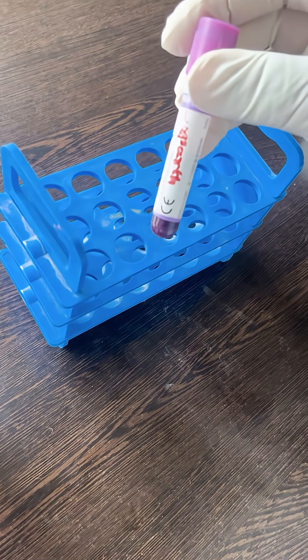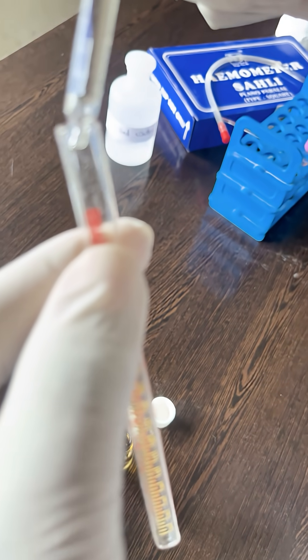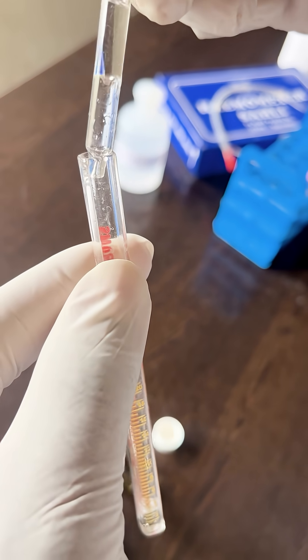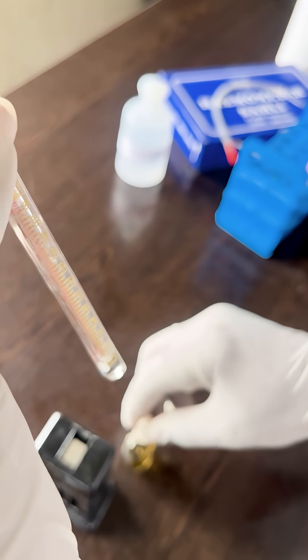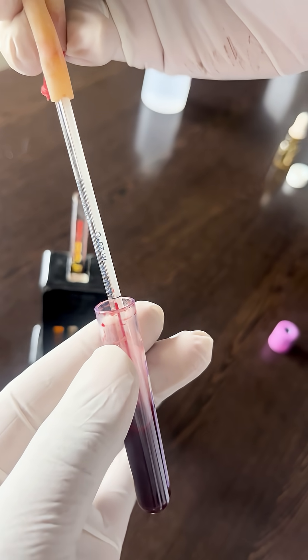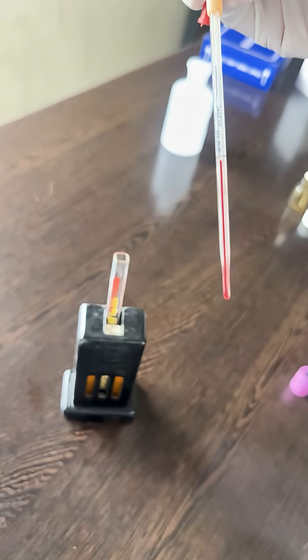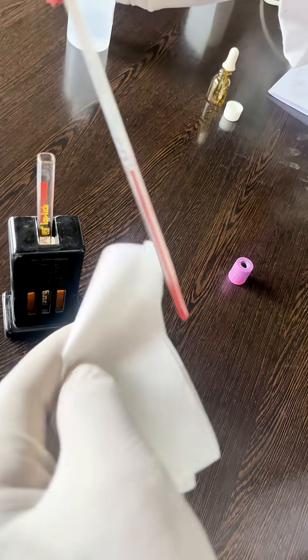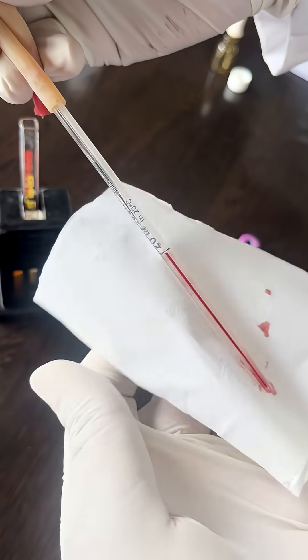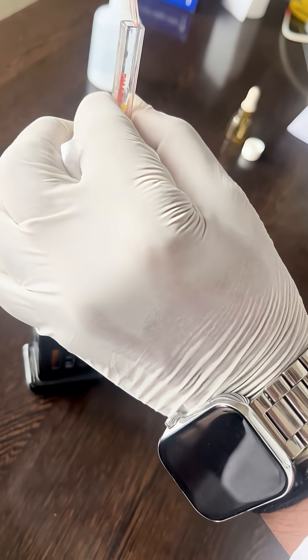In this test we use capillary blood. First, we need to add N/10 HCl into the graduated tube up to the lowest mark. Then take 20 microliters of capillary blood into the Hb pipette up to the mark. Wipe off the excess blood using a tissue, then add it into the N/10 HCl.